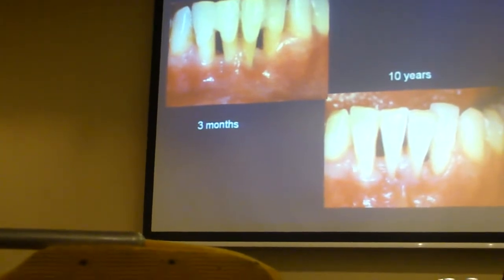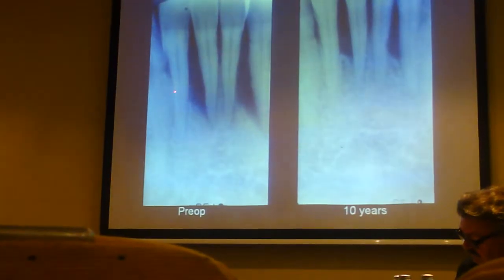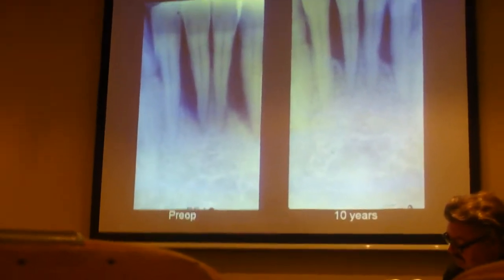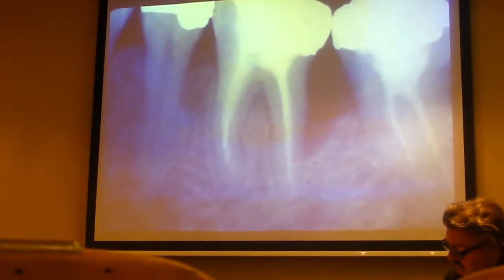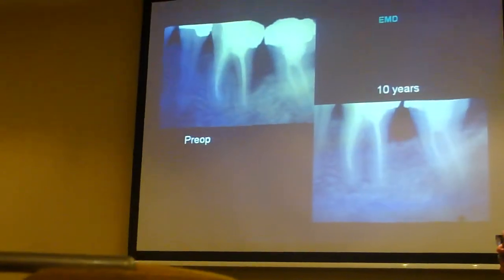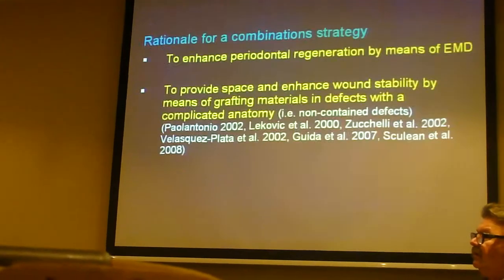So all these teeth were preserved up to 10 years, and you can see that these intrabony defects are filled up with new tissue. So this is a very well-documented indication. And another example, very deep defect, and you can see a complete fill of this defect. And if you compare the preoperative situation with the situation at 10 years, it looks quite stable. So a 10-year period is a very long time in dentistry.